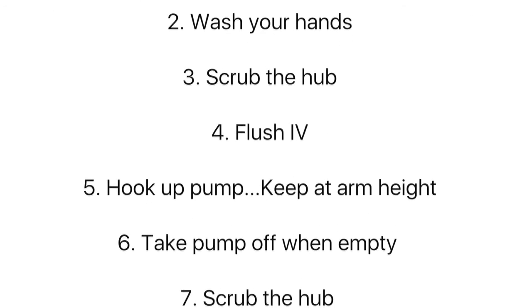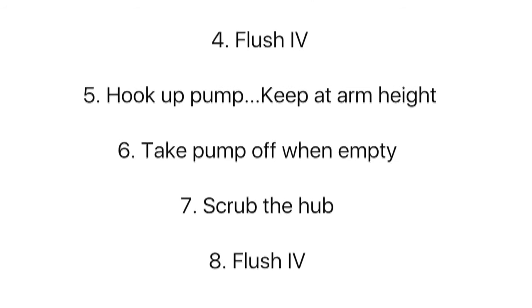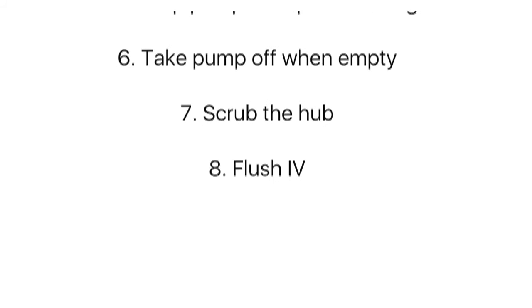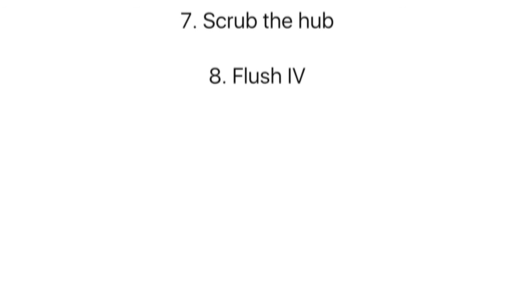Then you're going to hook up your pump. And remember, once it's hooked up, you need to keep it at about the height of your arm so that it runs at the right speed. When the balloon is empty, you can take the pump off. Then you need to scrub the hub with an alcohol swab for 15 seconds and let it dry for 15 seconds. And then flush your IV to make sure you flush all of the medicine into your body.